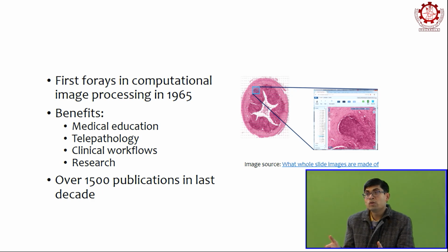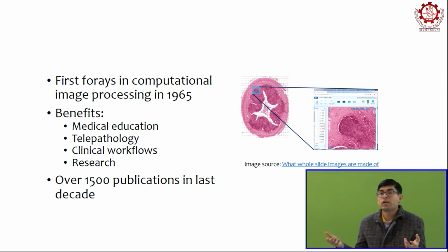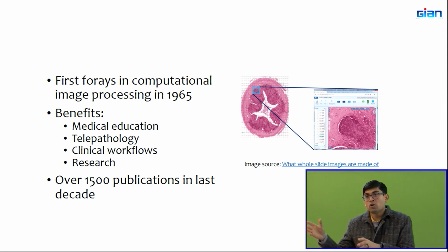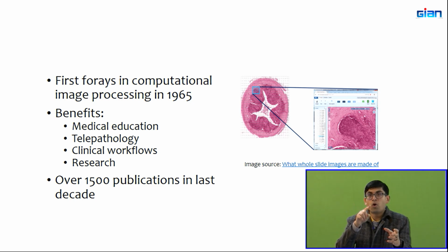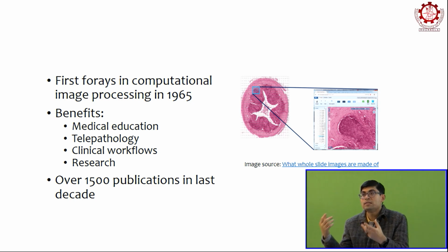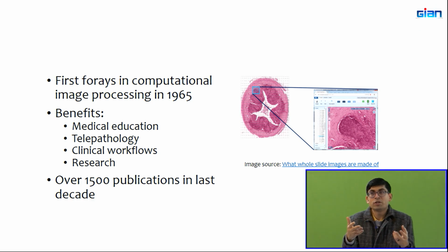Or you can open screen sharing and have a collaborative session where the specialized pathologist looks at the same region as you are looking, and they annotate what regions are important, or if there's a particular disease that the tissue has. While they call what disease it has, they can tell you what parts of the image were responsible for detecting that the patient has that disease.